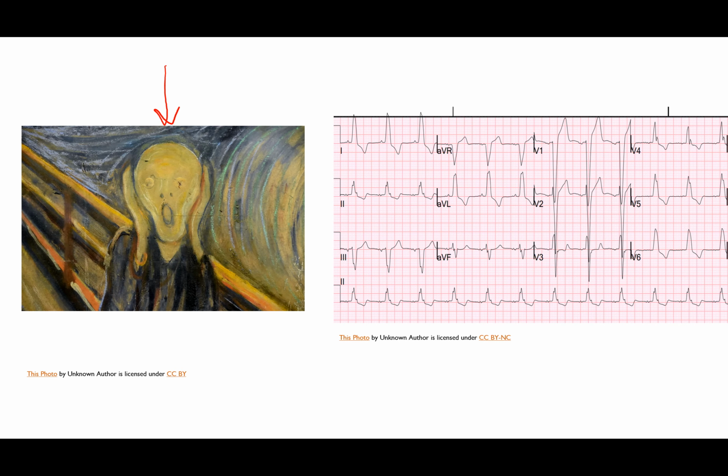So what we're going to do is actually take some time and develop a system for breaking down the different parts of an ECG, and we'll talk about what those parts are here in a minute. And I'll just say briefly at the start that this idea of a simplified systematic approach is pretty common. You'll find it in lots of ECG textbooks and helps, and I'll share a couple of resources at the end of this lecture if you want to read a little more about it.